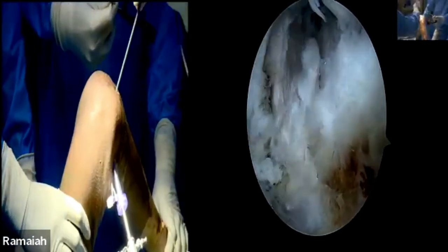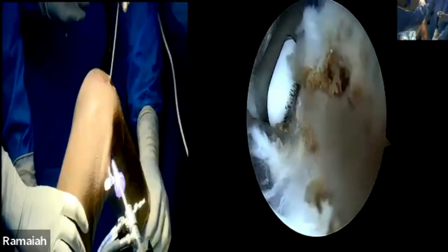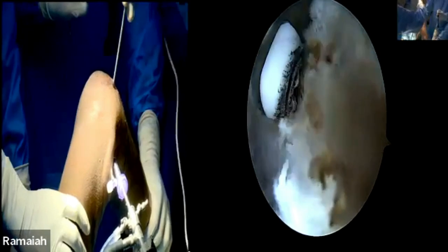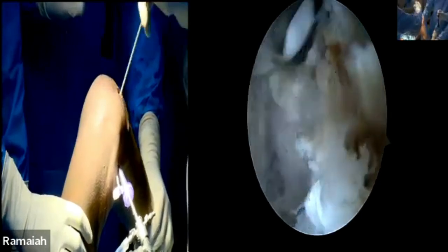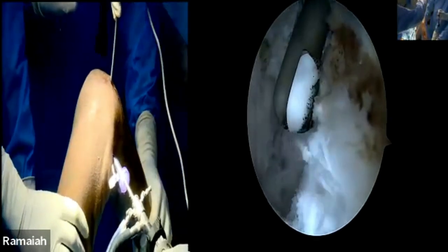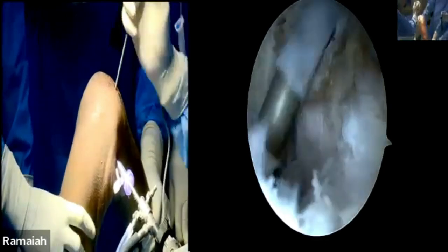This is the slope you generally see in the X-ray, and the slope suddenly drops in this area. Using radiofrequency you can appreciate the sudden champagne glass drop — see how it suddenly drops there. From there the bone is visible — probably 10 to 15 mm — and I can definitely aim for at least 15 mm minimum, not less than that. When viewing through the arthroscope you can see the PCL insertion and place your jig.